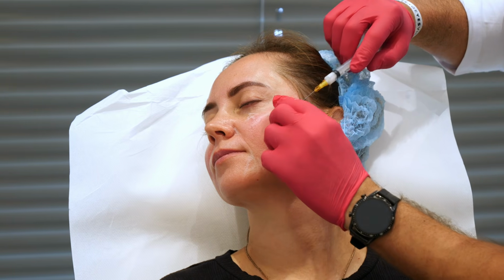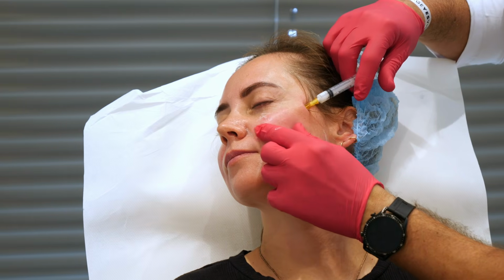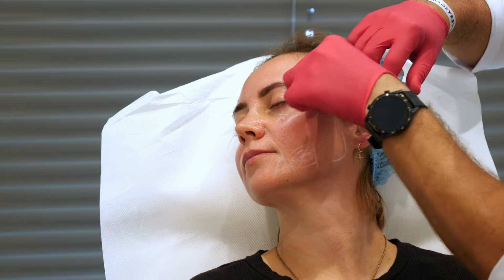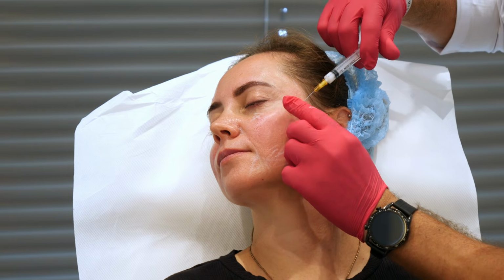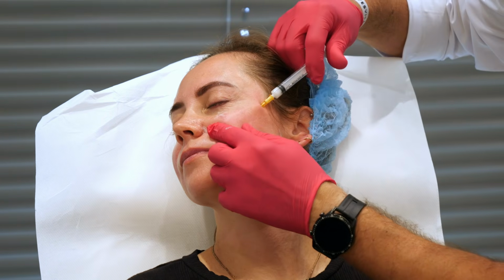There is a zone for Botox, for botulinum toxin, but with the polylactic acid, we can obtain better endurance and strengthen the skin here, and this combination obtains a very good and enduring result.